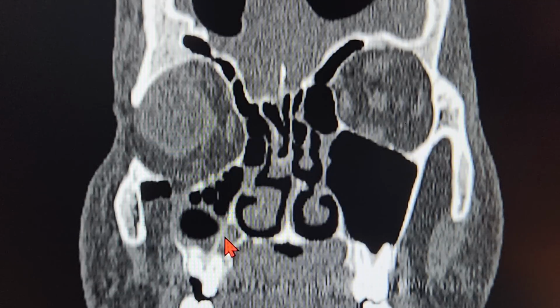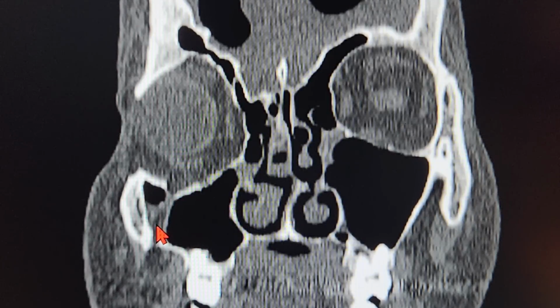And towards the posterior end, you can see the orbit is very low. You can see there's some kind of floor of the orbit fracture over here. You can actually see that the patient's right side orbit is stooping down. On the left, this is the horizontal plane.